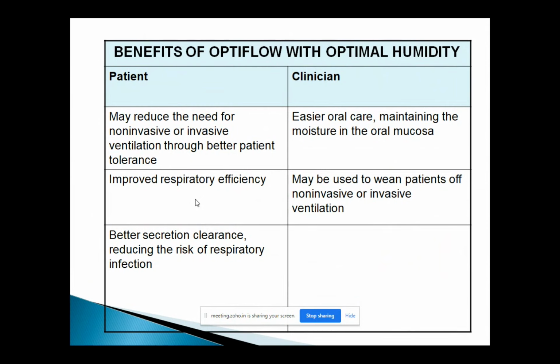There are patients who got intubated, or there are patients who got into non-invasive ventilation. But again, if the patient is going on non-invasive ventilation, and if you want to give them a break for their lunch or food or medications, you can take them off and put them on OptiFlow, and you know that you're providing the right amount of treatment, and you know that the patient is getting the exact fraction of inspired oxygen. So there is a bit of confidence there.